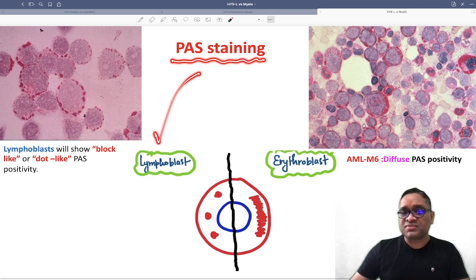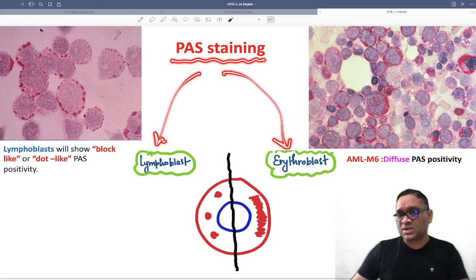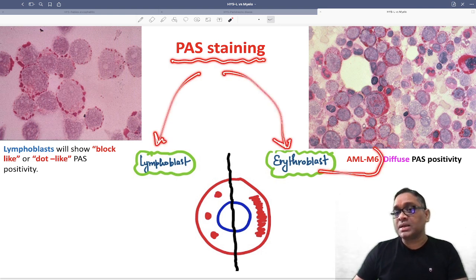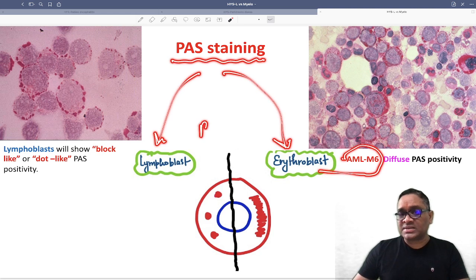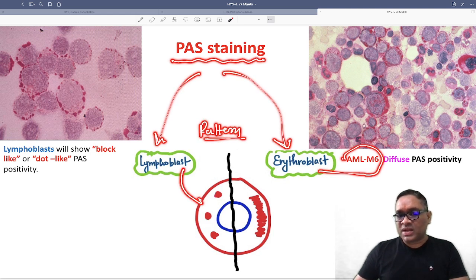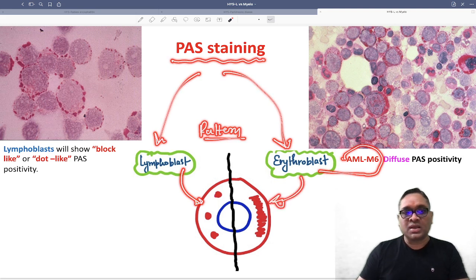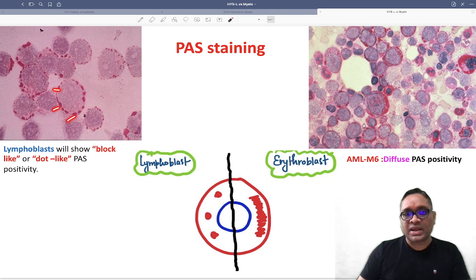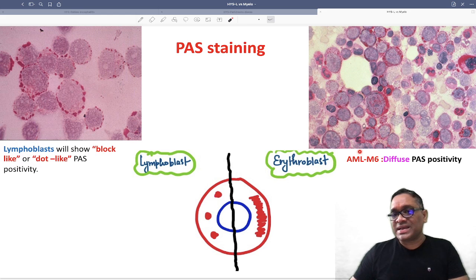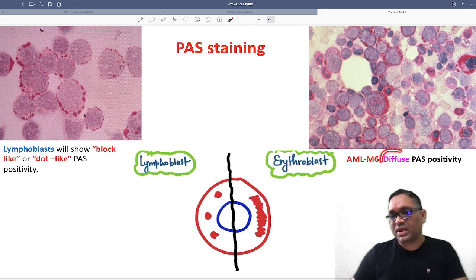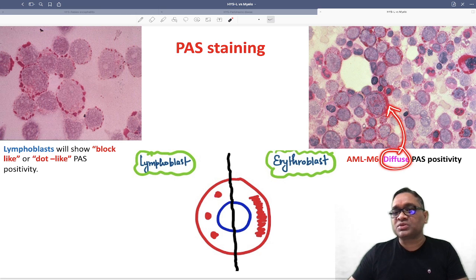Now let's see how PAS staining differentiates further, because PAS will be positive for lymphoblast and also for erythroblast, which is AML M6. The answer lies in the pattern of staining. Lymphoblast shows dot-like and block-like positivity, whereas AML M6 erythroblast shows diffuse PAS positivity. You can notice the diffuse PAS positivity here compared to the dot-like block-like pattern in lymphoblasts.